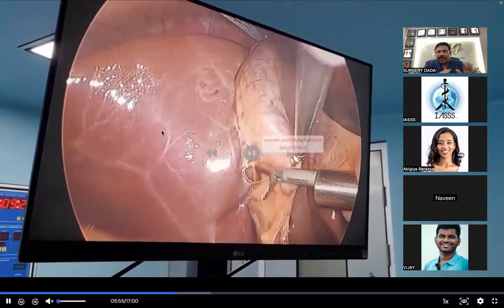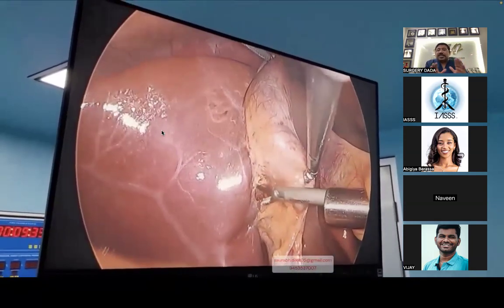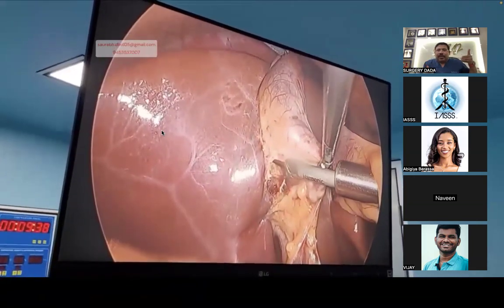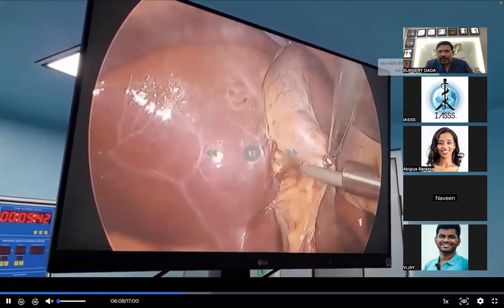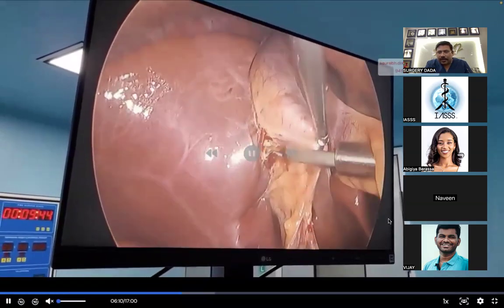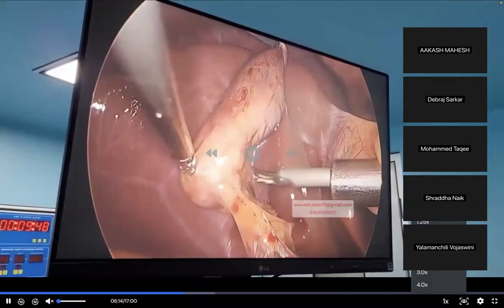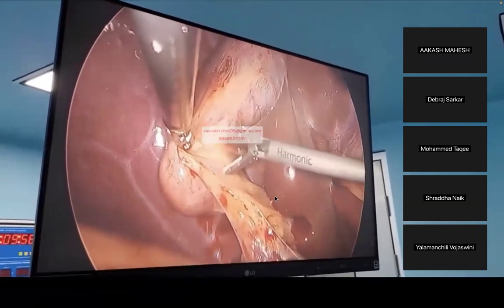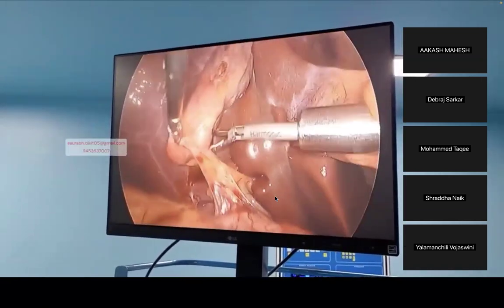I don't want to mess with the gallbladder. I don't want to mess with the liver. I don't want to mess with the hepatic structures. So let me pull my gallbladder away. And this is how I am starting with the cholecystohepatic triangle dissection. I'll increase the speed. Now you can see I am opening, what, students? It's just a series of anteromedial, anterolateral dissection.